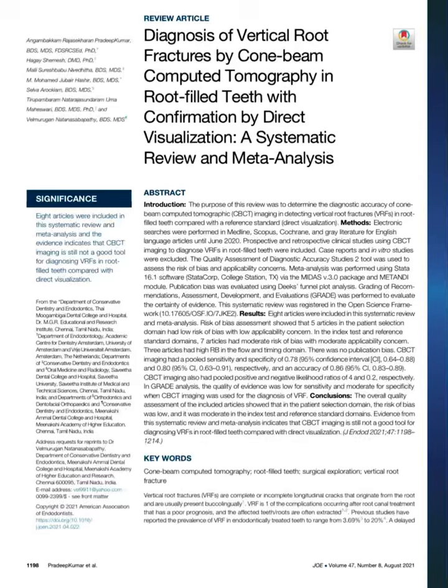The systematic review and meta-analysis concluded that the evidence indicates CBCT imaging is not a good tool for diagnosing vertical root fractures in endodontically treated teeth when compared with direct visualization. While CBCT may be useful as a diagnostic aid, it is not recommended for a definitive diagnosis. Direct visualization of vertical root fracture by surgical exploration is still considered the gold standard.